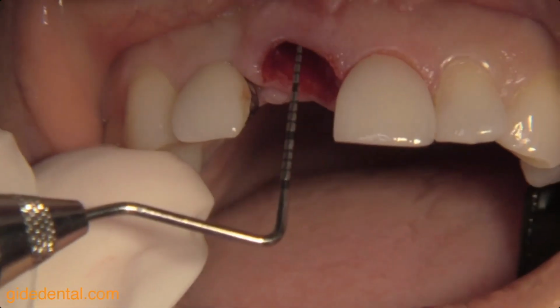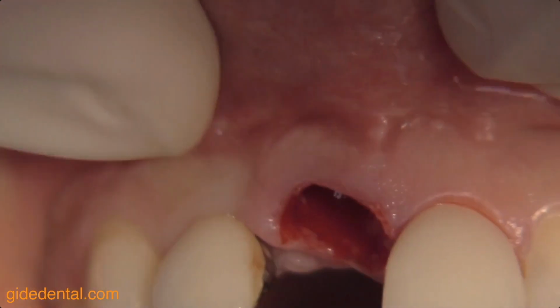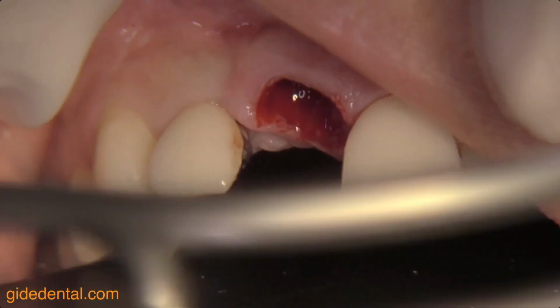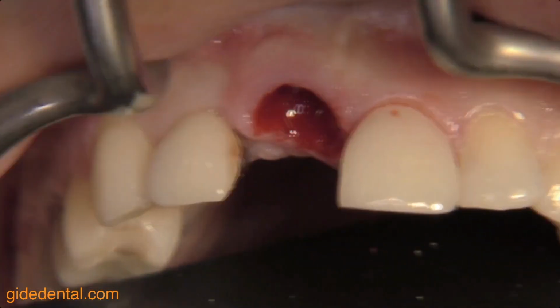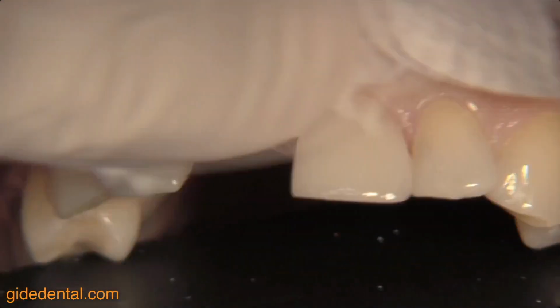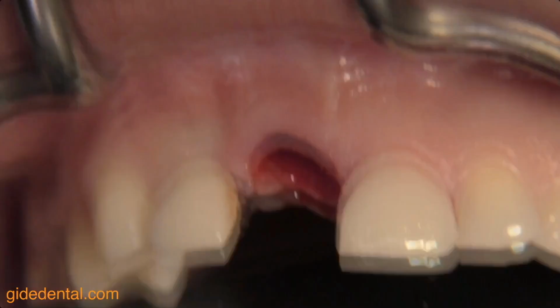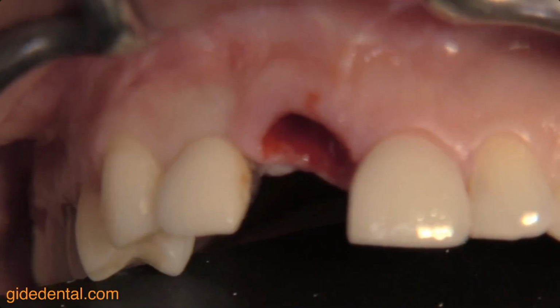Then I'm checking here with my periodontal probe, my 1 millimeter increments here, that actually is the crest of bone within 3 millimeters, following the biological width principles and biological height principles from the gingival margin. Because remember, I want to maintain that gingival margin where it is. So here it is.